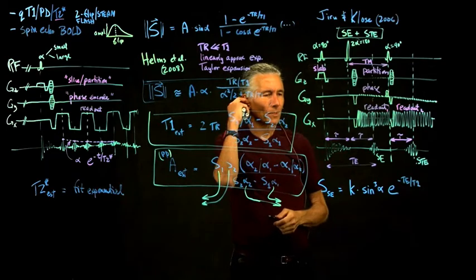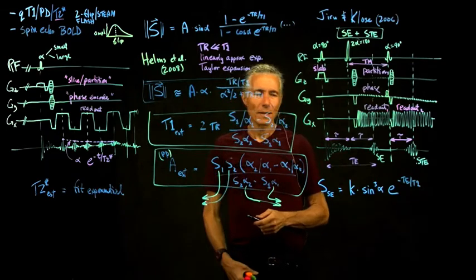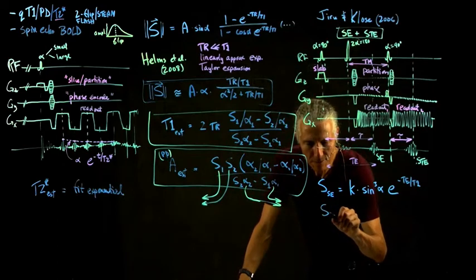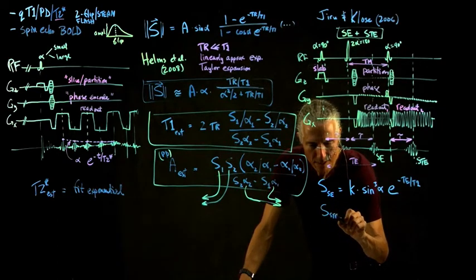Okay, so that's our spin echo amplitude, but the stimulated echo amplitude is different. So the stimulated, that's where I had the error in the equation.